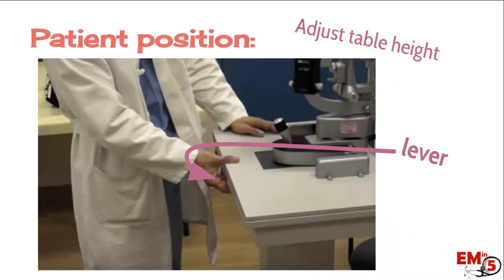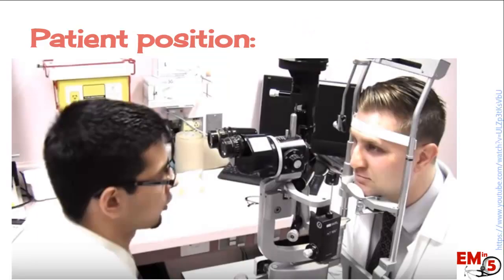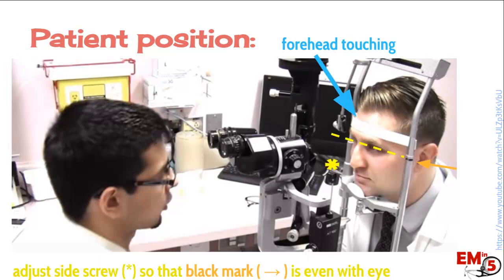Next, we have some different positions for the patient. The first is for the patient's comfort — that's the table adjustment. There's usually a lever on the front part of the table towards you; adjust it so it's comfortable for the patient and yourself. For the exam positioning, two things: the patient's forehead has to be touching the white strip, otherwise you will never be able to focus correctly on the patient's eyes. Second, this black mark on the side has to be even with the patient's eyes. Adjust the patient's chin using the chin rest dial on the side.